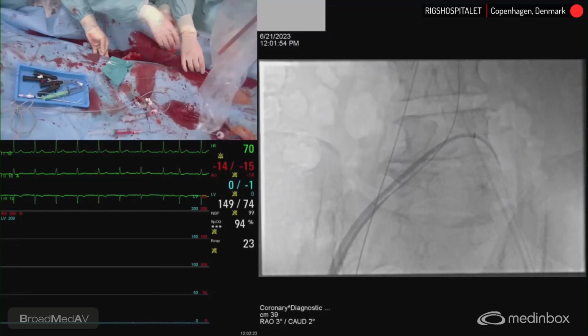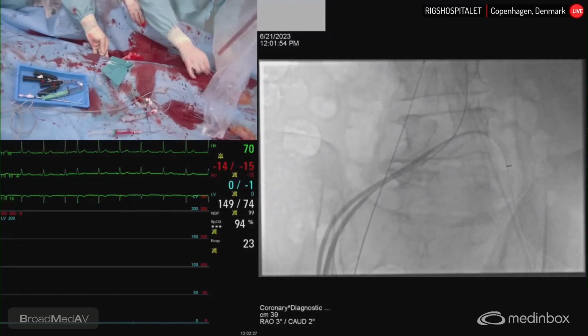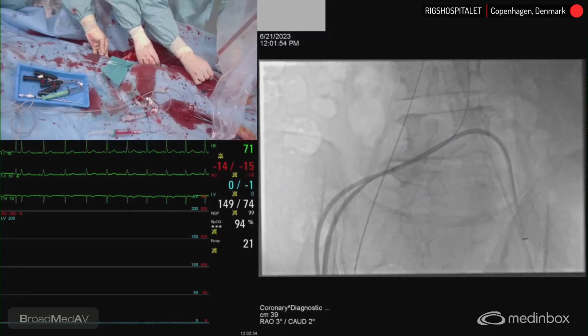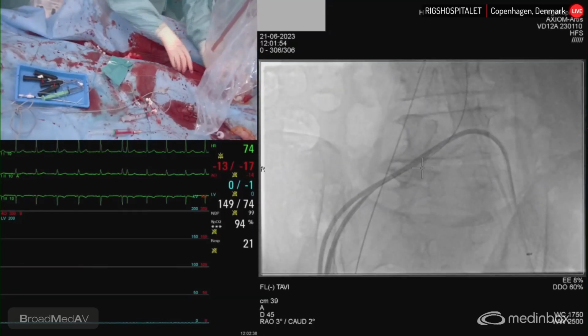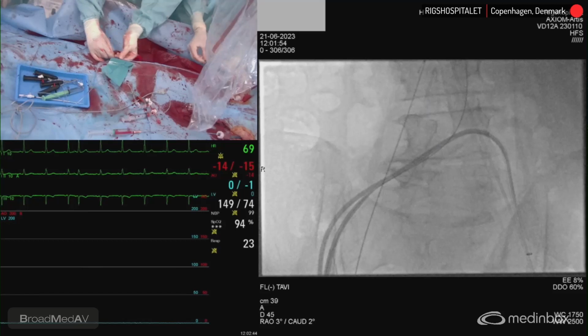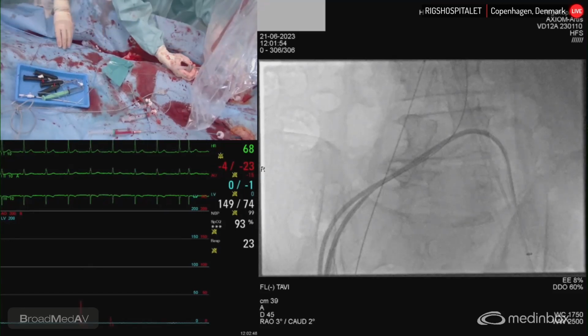Can you go another way? Well, it's even not necessary, I think. Push like that. All the way. You go like this. And you push like that. Yeah. See, so now we can do anything we want from this here. So yeah, you hold it. You take the dilator out, please. Keep the wire. All right. Just flush this. All right, and then we're going to close.